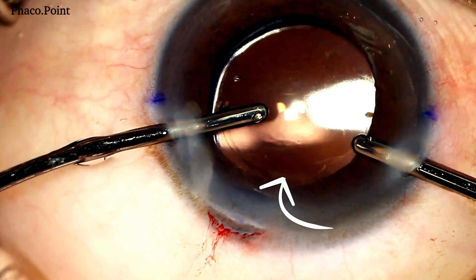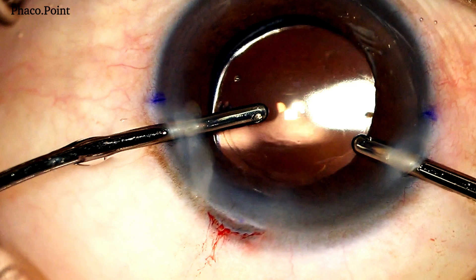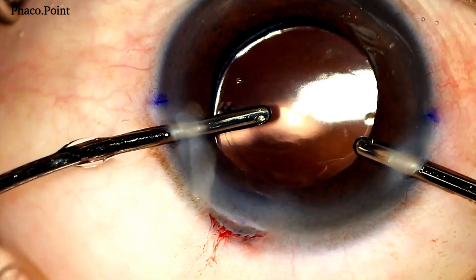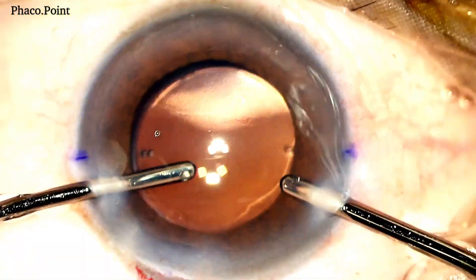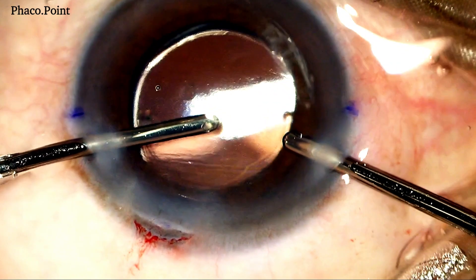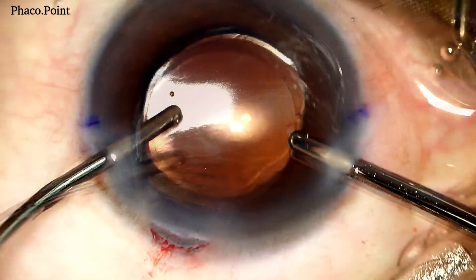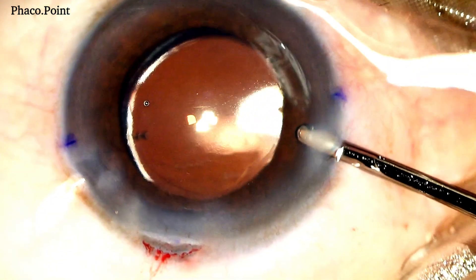Notice this fuzzy image that comes into play when you align the first and the fourth images. This is the third Purkinje image, which is formed on the anterior surface of the optic, and it is virtual and erect. What we need to ascertain is that when the eye is held perfectly aligned in the visual axis, the points on the IOL should be perfectly in line with the marks on the cornea. Once this is achieved, you know that the IOL is perfectly aligned in the axis it was meant to be placed in.